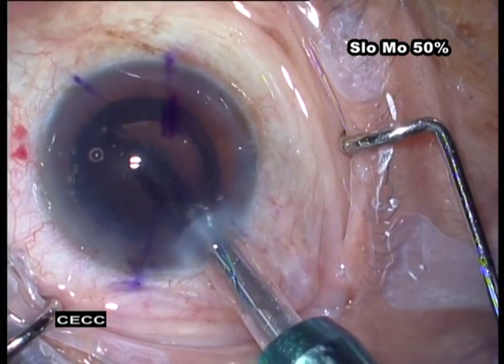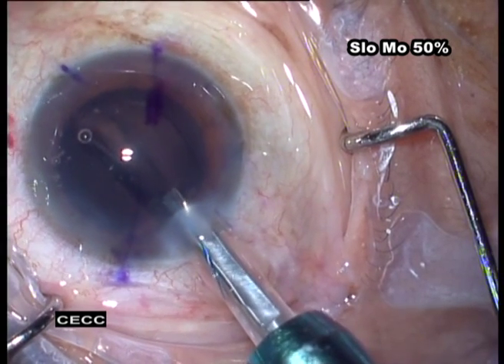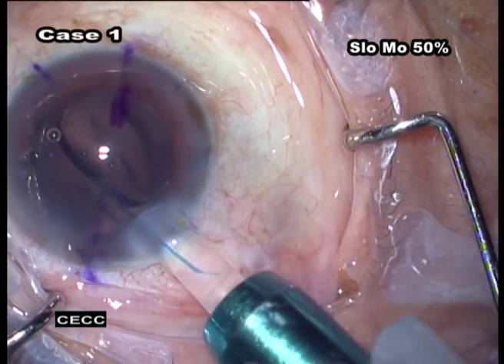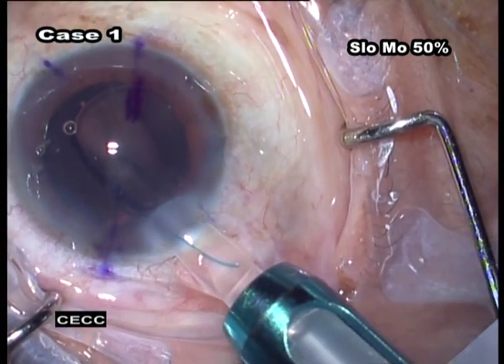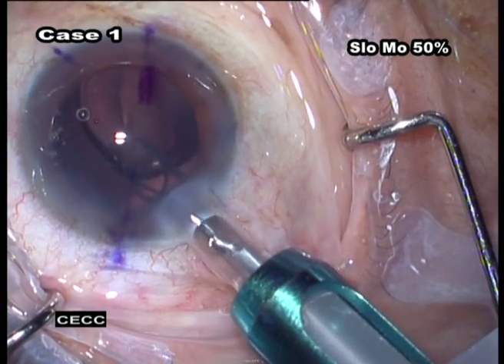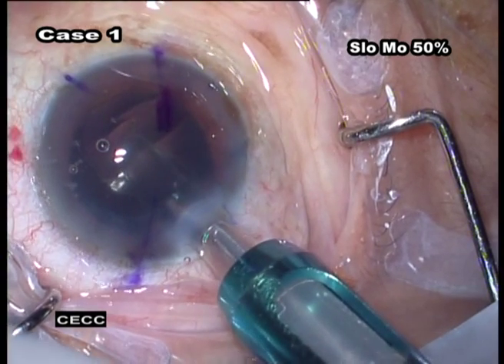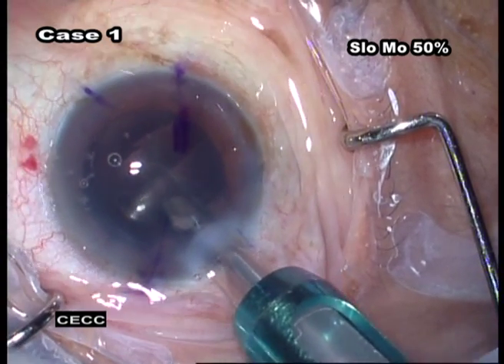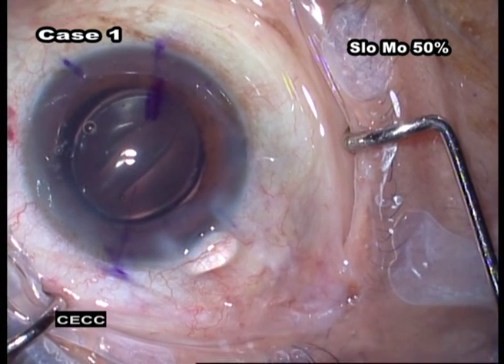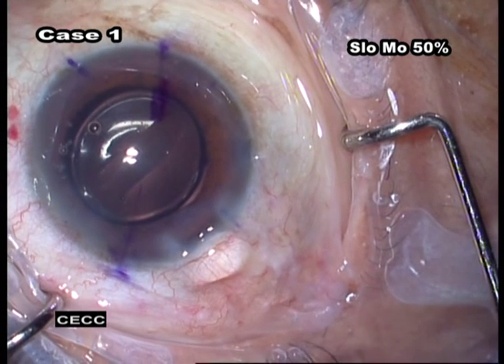Observe the location of the trailing haptic within the tube. The cartridge tip can be used to hold the optic in place during rod retraction. Retract the rod tip just behind the trailing haptic. Rotate the cartridge clockwise until the bevel is pointed down. Engage the trailing loop with the rod and place the loop into the capsular bag, as you see in this case. If the IOL is completely released with the bevel down, the IOL may release upside down.